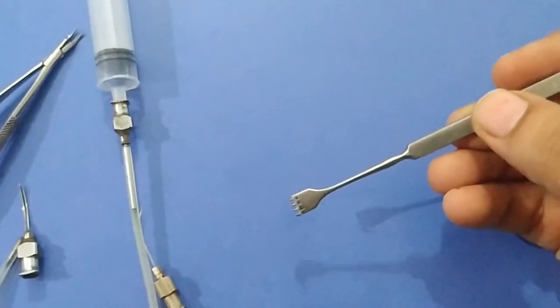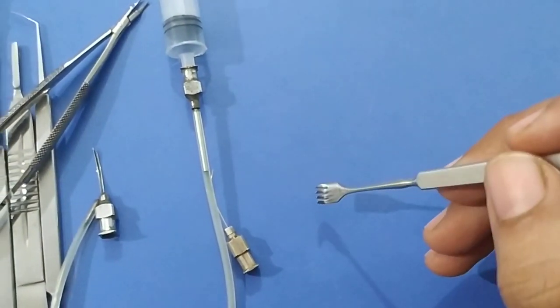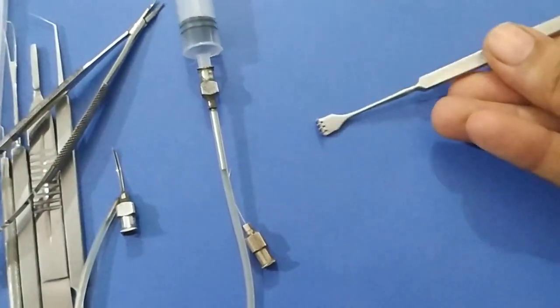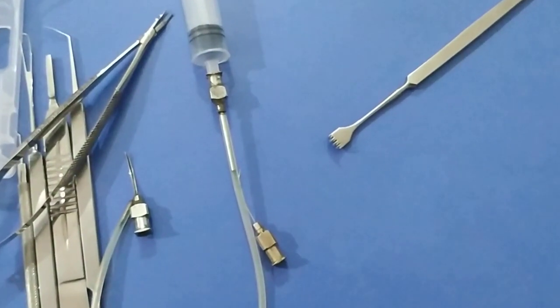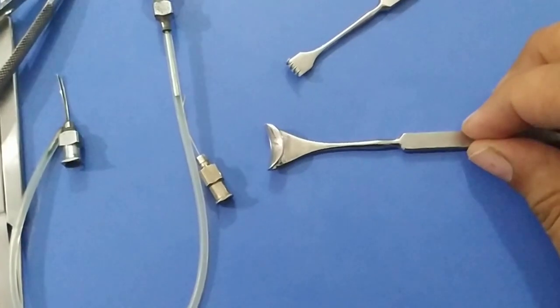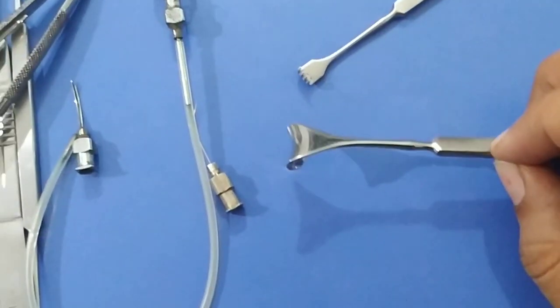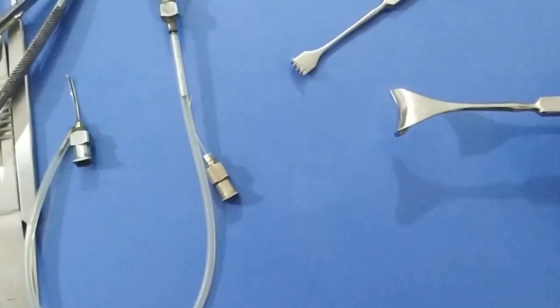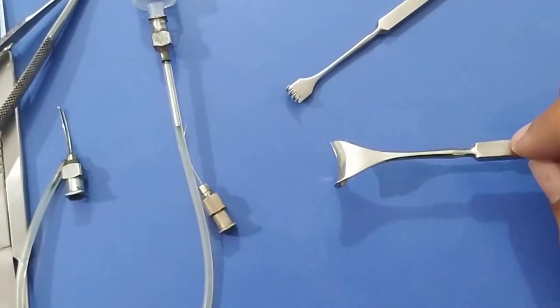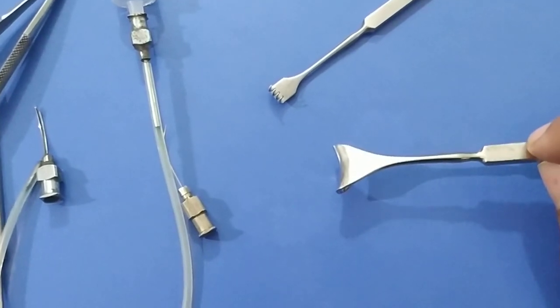This is a cat's paw retractor. It is used during DCR and DCT surgeries to retract the lacrimal sac. This is a Desmarres lid retractor. It is used in cases of blepharospasm or in pediatric patients to keep the lids apart for examination. In patients with severe lid edema or ecchymosis, it can be used to examine the anterior segment.